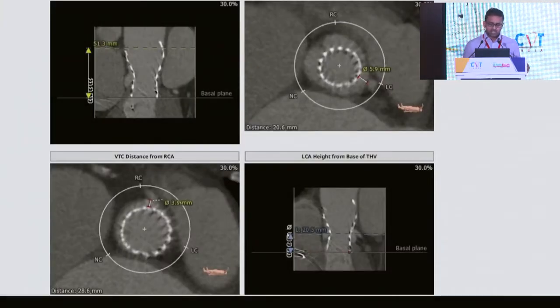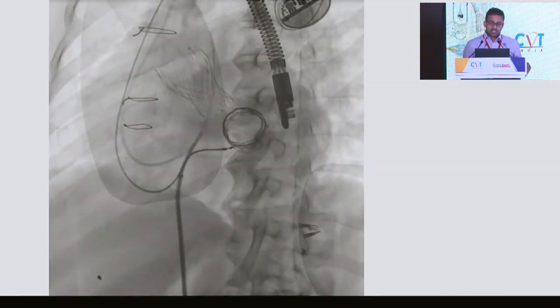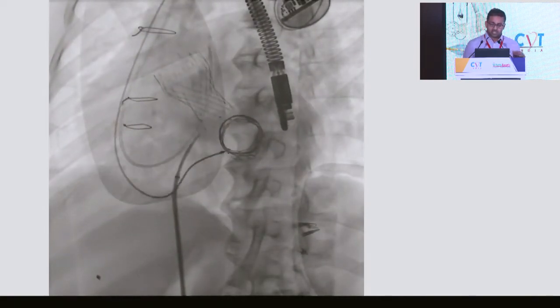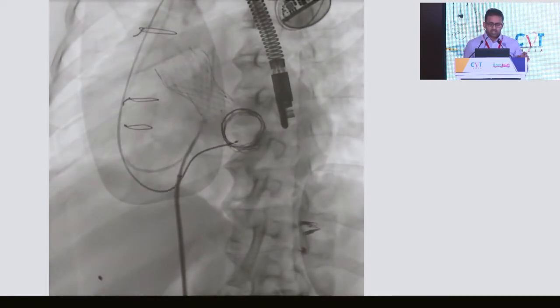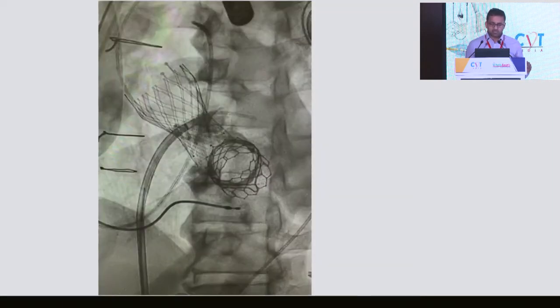Now, what are the other procedural considerations? You can see here, this is the VTC, valve to coronary distance. So we need to make sure we don't occlude the coronaries. And these are the baseline images. You can see here the TAVI. This is a coaxial view of the TAVI device. You can see the mitral valve-in-valve. The patient also had a mild paravalvular leak. So we also had a transseptal approach ready, but we didn't do anything.